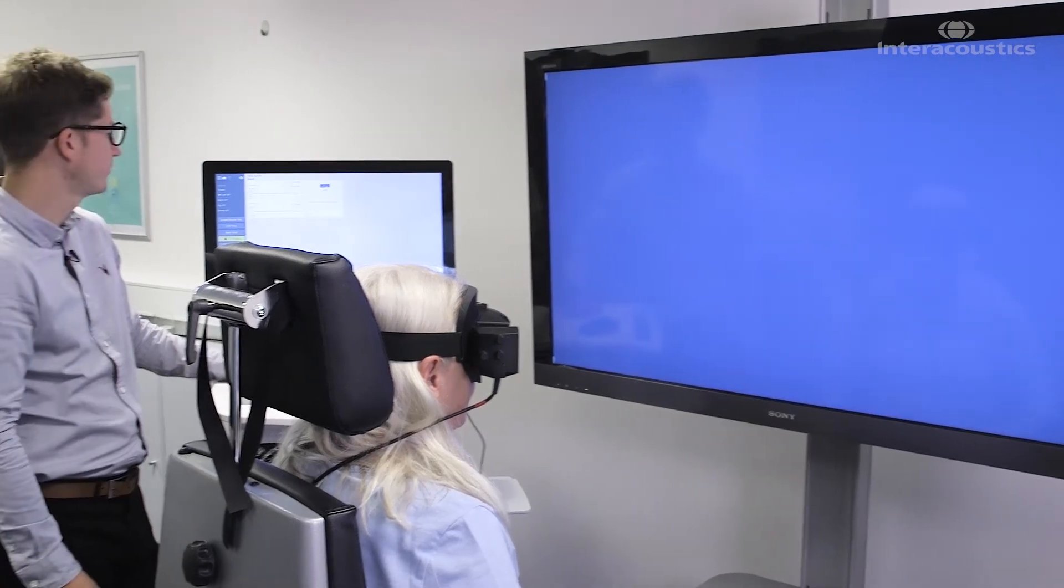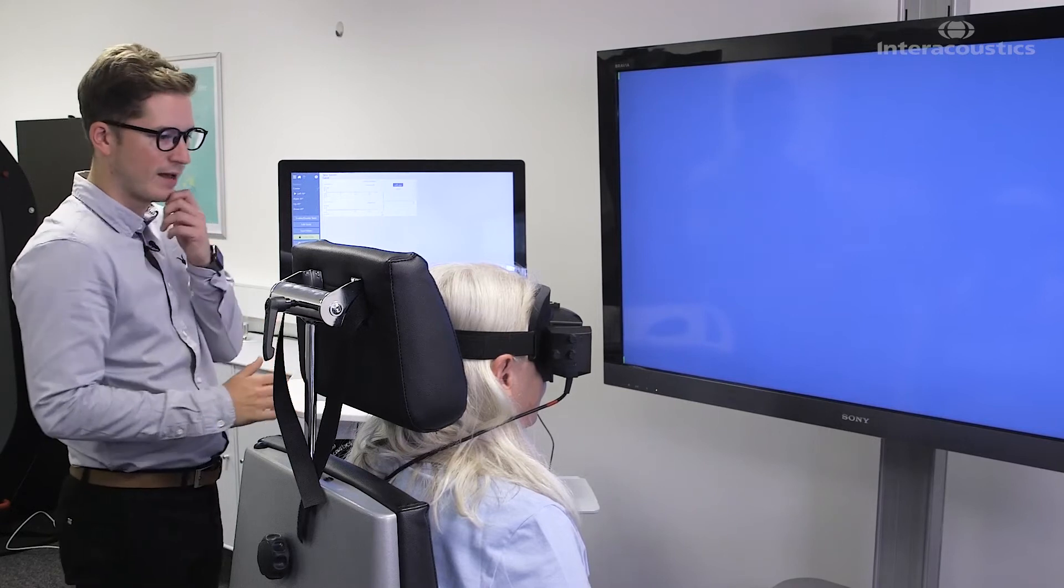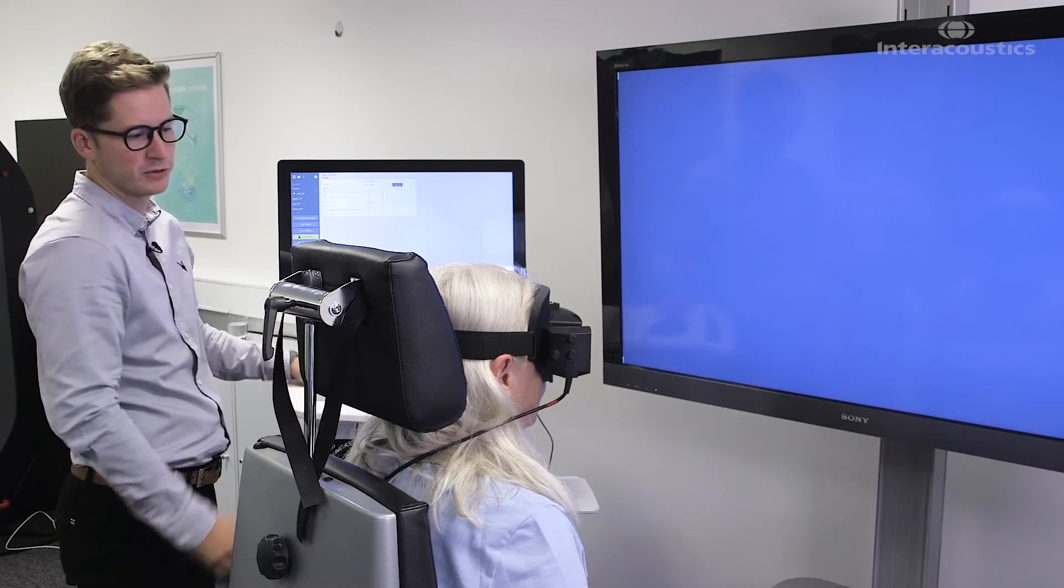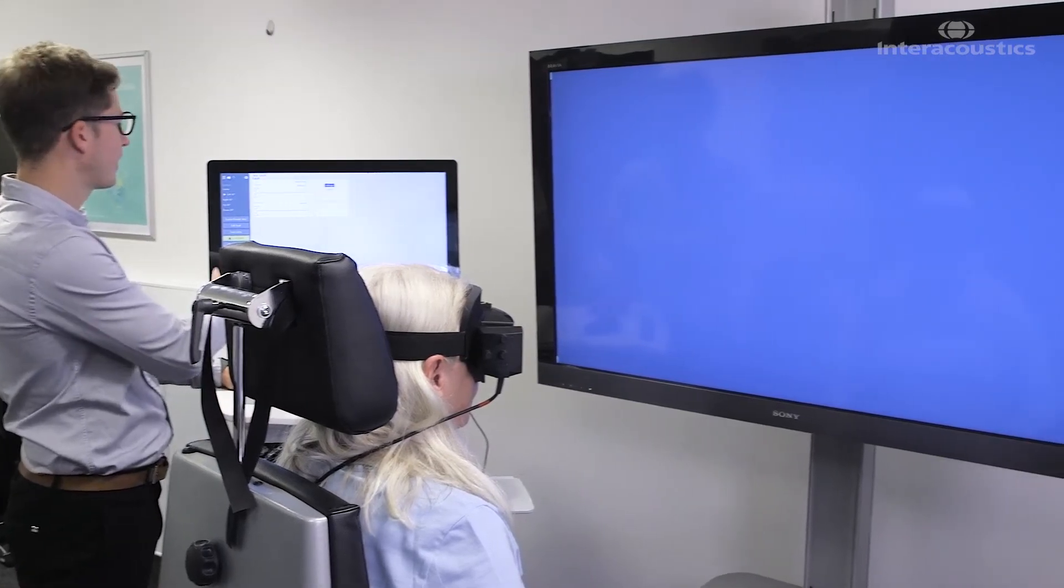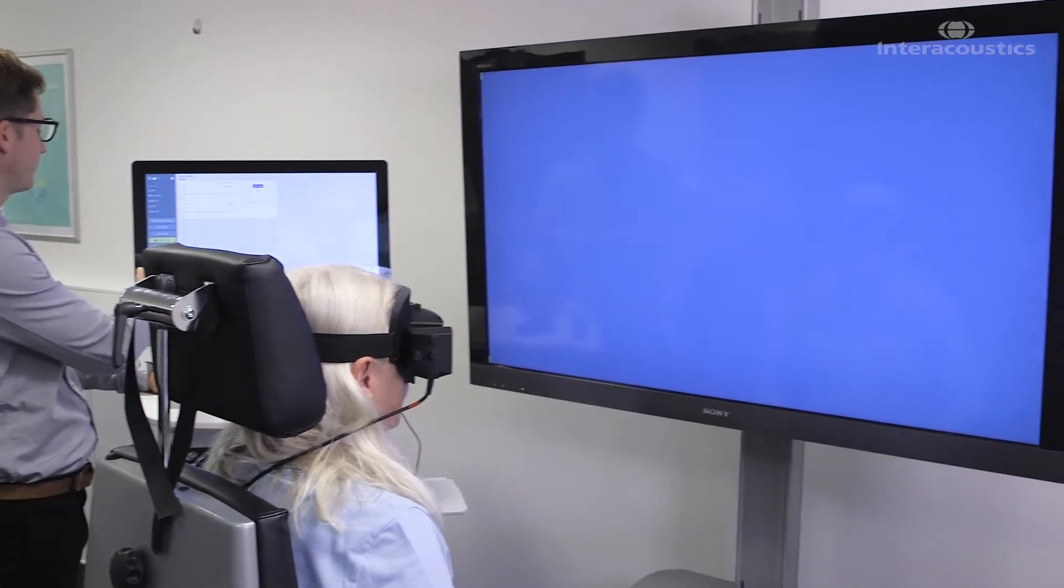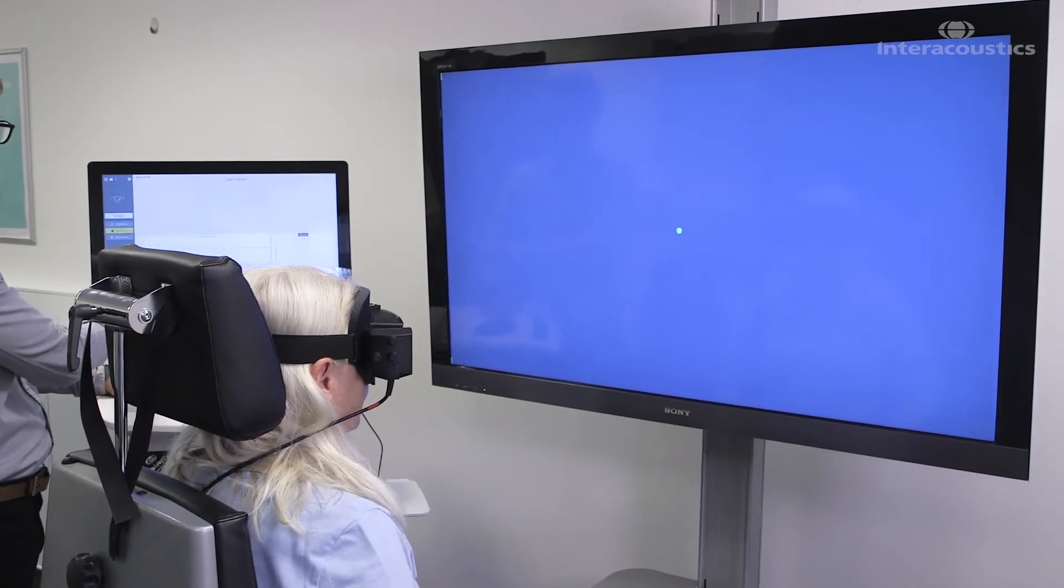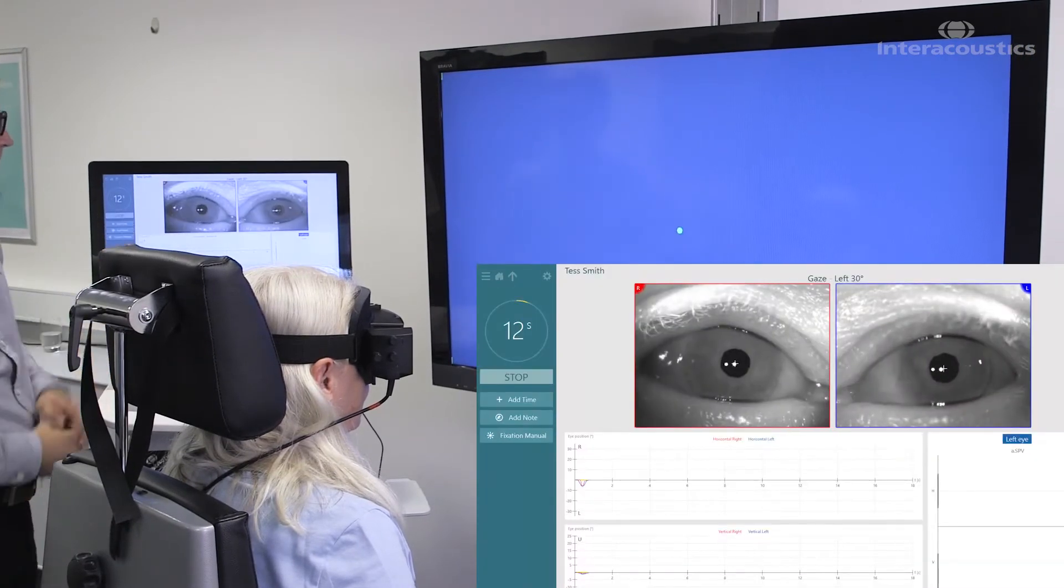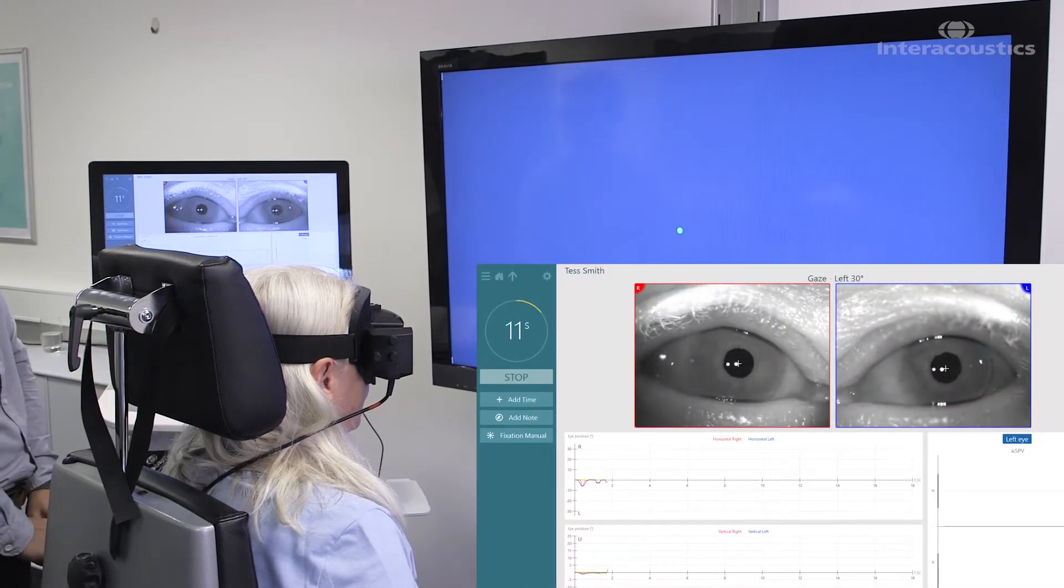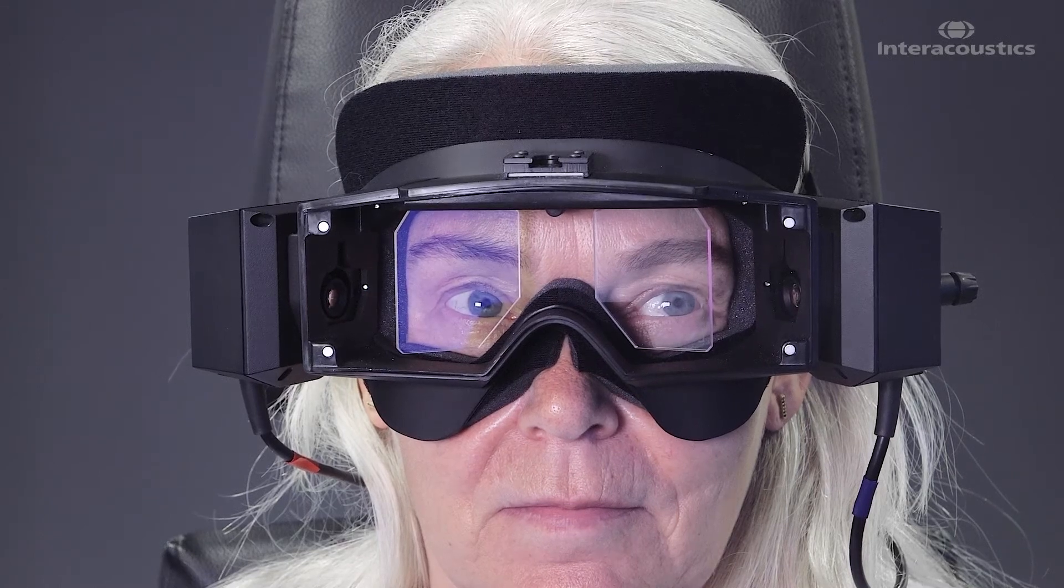Okay, so what's going to happen this time is the target's going to move to the left and I want you to follow your eyes, follow that target with your eyes. Counting down from 12. Okay, looking at the center dot and to the left.